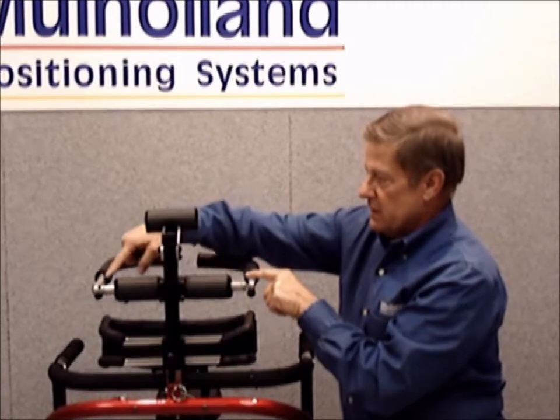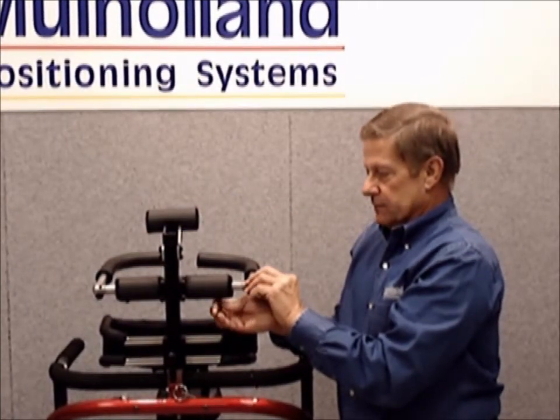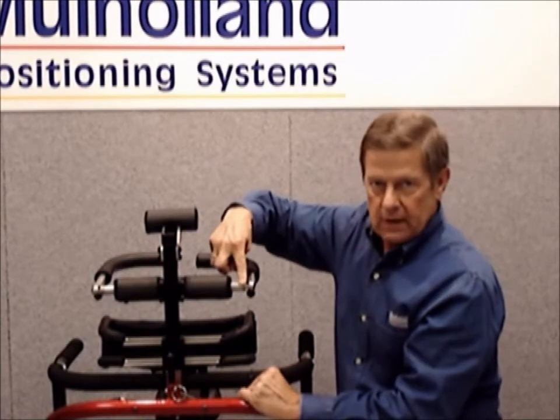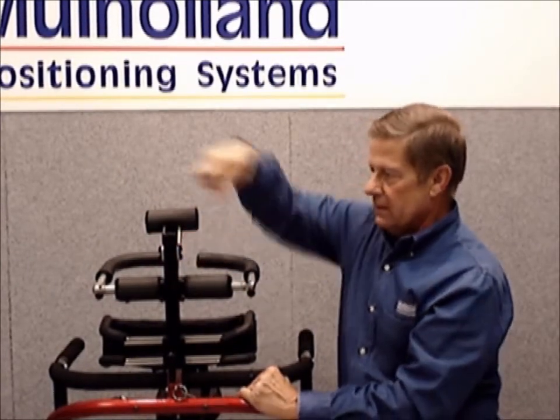Find your desired measurement for width. Tighten the Allen screw on the bottom side. You want to make sure that the distance on the right is the same as on the left before you tighten it to ensure that you are symmetrically aligned to the vertical column.